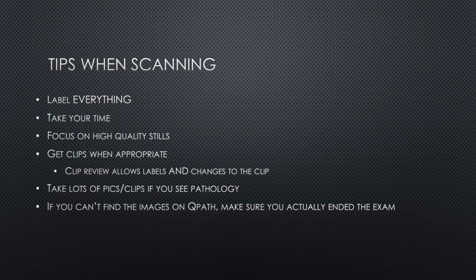And then, like I mentioned on the last slide, if you can't find the images, overwhelmingly, the exam wasn't ended yet on the machine. This comes up every month or so. Someone says they can't find their images, and it turns out it just didn't end the exam the whole time.